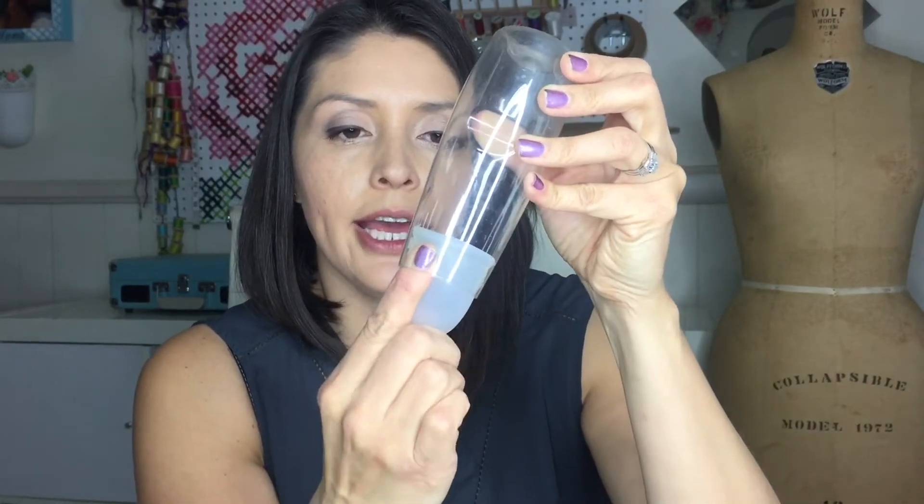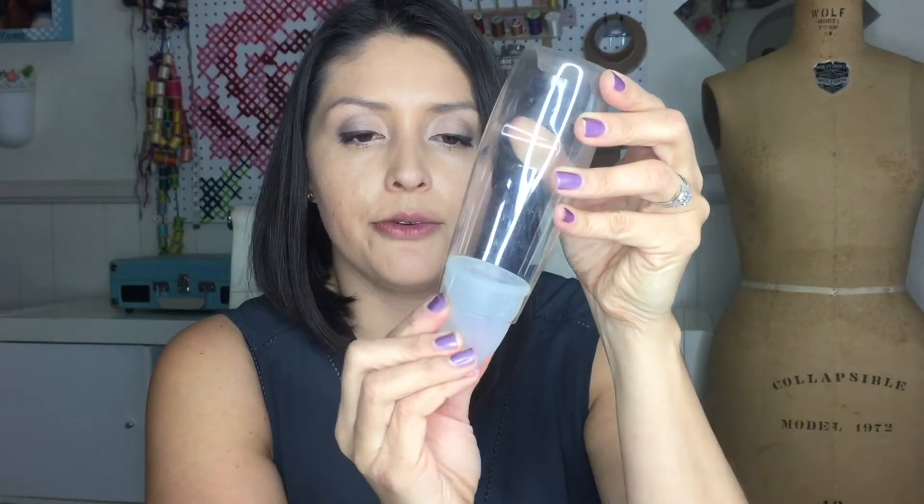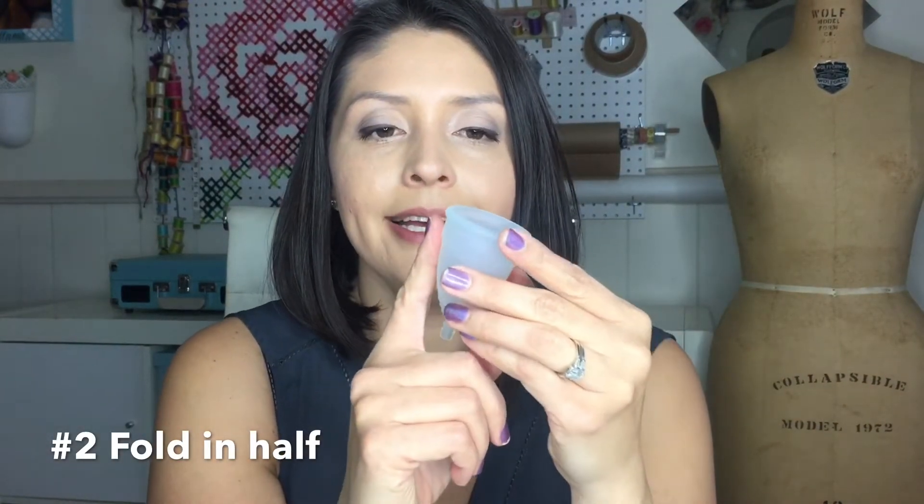One method I use to make sure it unfolds is to insert one finger and spin it around a bit, just to make sure you get all the air out and it unfolds completely. The last thing you want is a little leakage and you've ruined your pair of pants or whatnot.